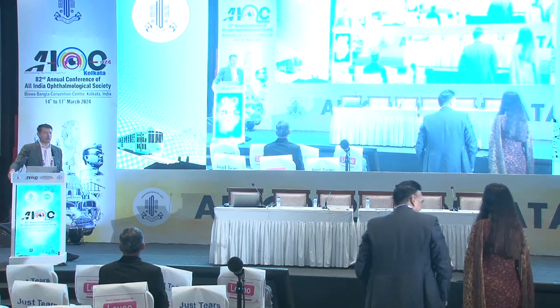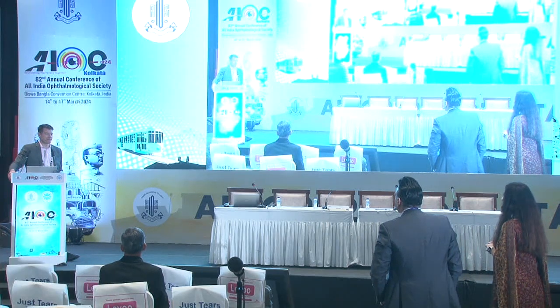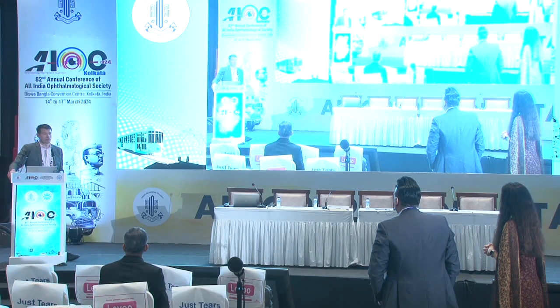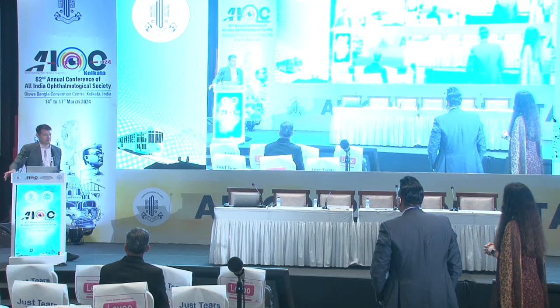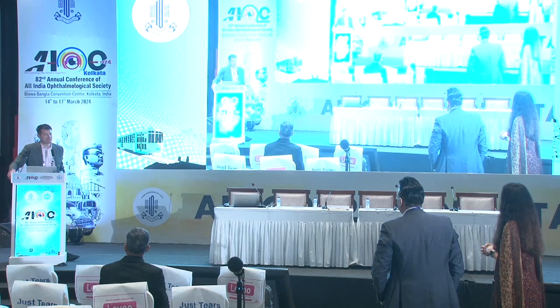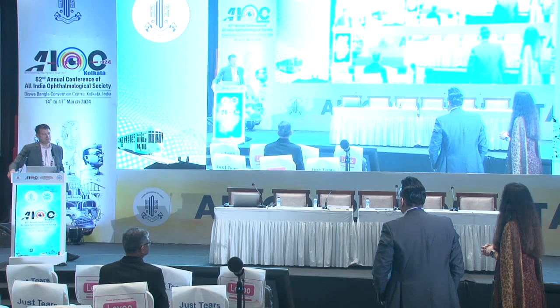I'd say if I know the patient's going to need DMEK and cataract surgery, 95% are combined. Mine are too. If the view is just really bad, and they need cataract surgery, I'll do the DMEK first, then cataract later. Obviously, we have these patients with mild corneal edema where I try to get away with the cataract surgery first and then DMEK later if necessary. But in those, I know we're going to need both. It's almost always combined or rarely DMEK first.